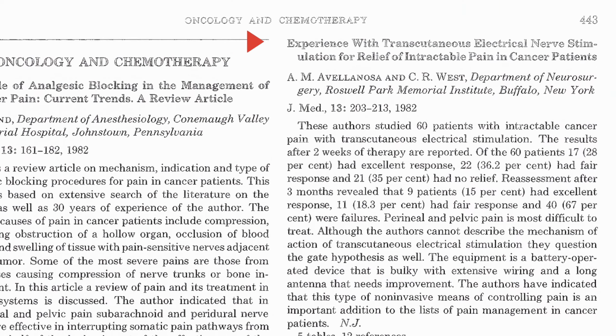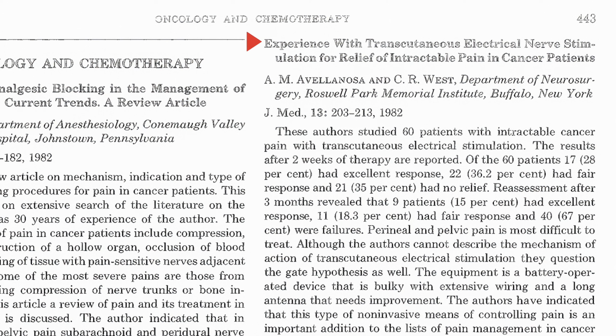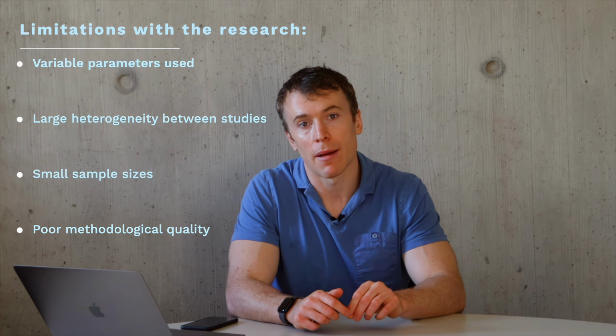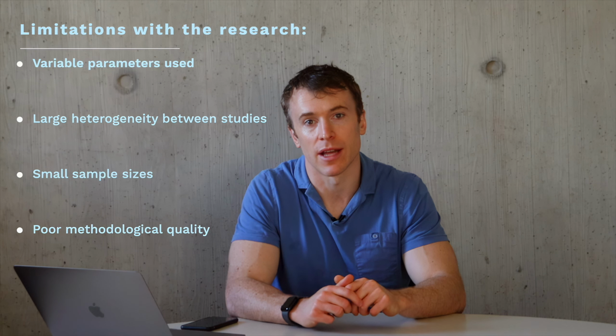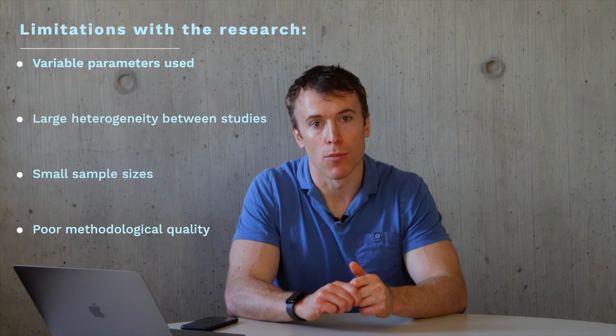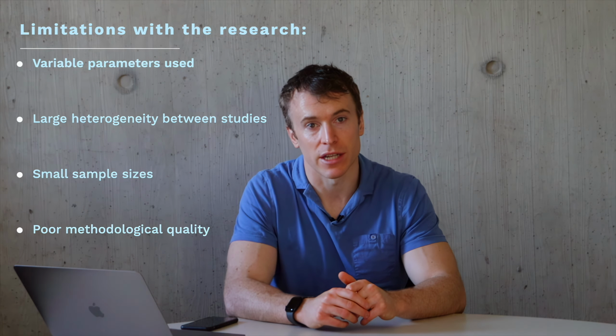Still, TENS is widely used in certain settings, and there are a number of case reports and uncontrolled studies suggesting that it may be effective, albeit with limited duration of benefit. The prevailing shortcomings in the field of research investigating electrophysical modalities are present here too. We just don't know the parameter-specific effects of this modality and whether, for example, certain dosage parameters may be more or less suitable for different injuries or impairments.